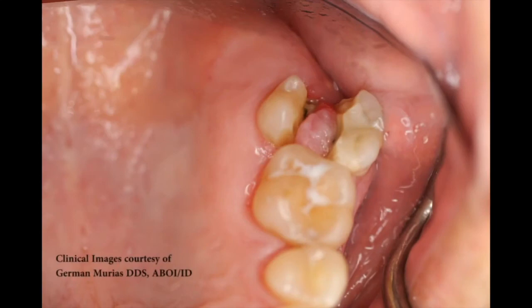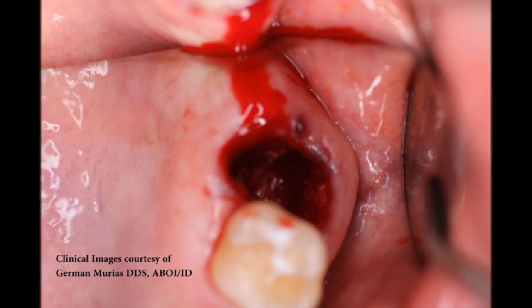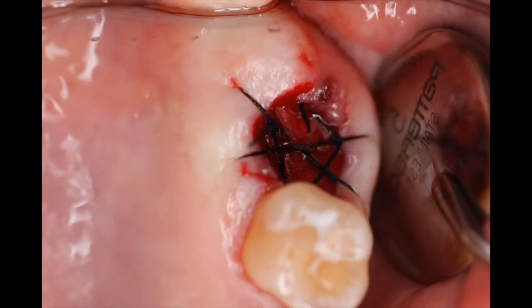In this clinical example, tooth number 15 is set to be extracted, and the socket was thoroughly debrided to trigger the regional acceleratory phenomenon, commonly known as RAP. This procedure is known to stimulate bone formation and graft incorporation. Two slim OsteoGen bone grafting plugs were inserted, and sutures were placed over top. Note that no membrane was used, as there is no chance for particulate washout.